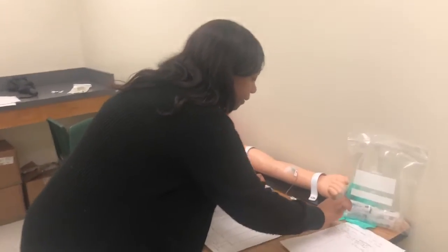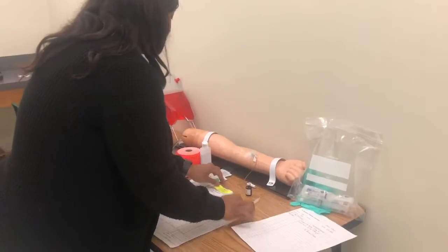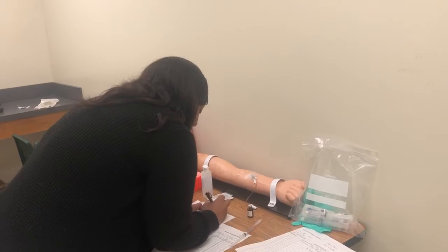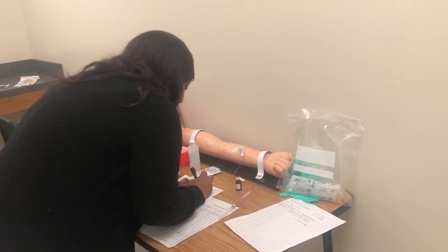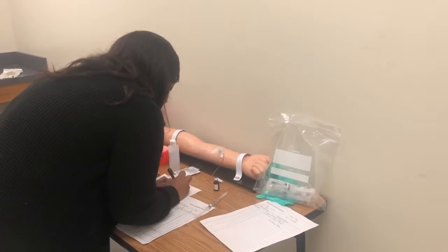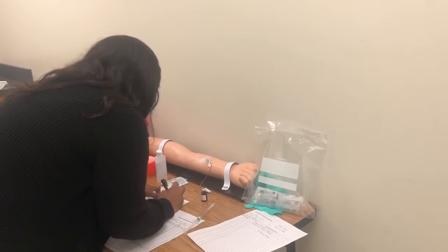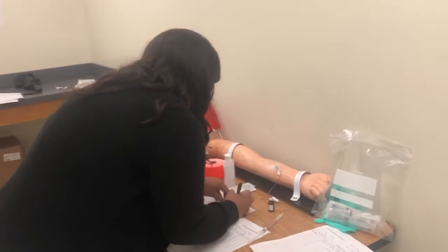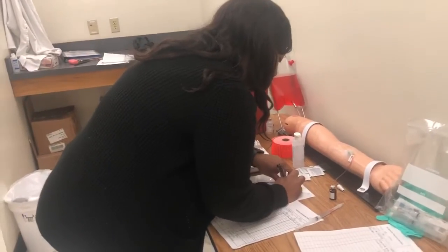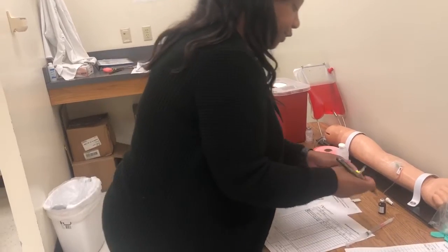Recap. Okay, and I label. Patient is Ms. Janet Green. Drug is furosemide. Amount is 30 milligrams for 3 milliliters. Prepared date is 2/5/2020 at 4:49 p.m. Prepared by Victoria Harris. Expiration date. So I label my syringe.